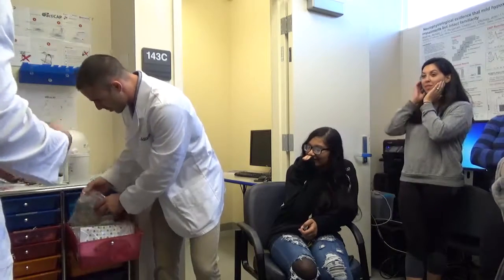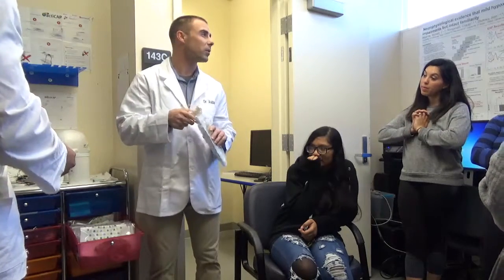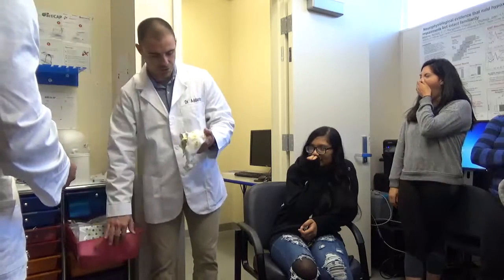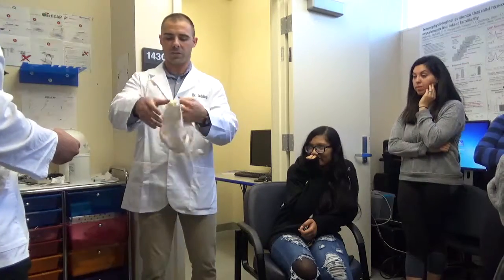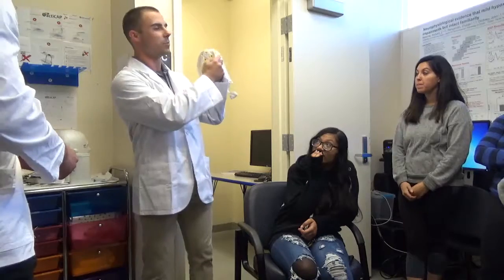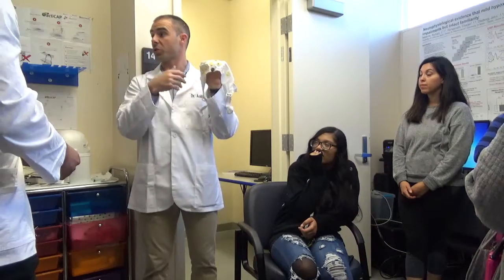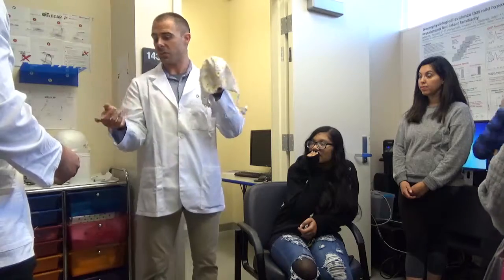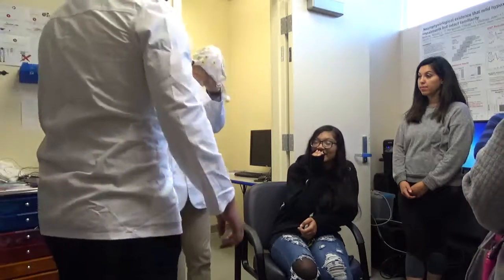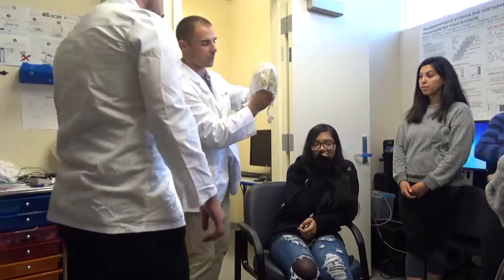Yeah. So, anyways, what do we say was 54? 57. 57, okay. So we have 56 and 58. Let's do 58 because we don't want it too tight on her. It's a long time to have something cramping down on your head. Alrighty, so let's see here. The way that this will work is, first of all, the black goes in front. And GND stands for ground. Like a lot of electrical measurements, we always want a ground measure. Okay? And so we'll work on it as a team to put that on. You can put that back down there. We start from the front, and the way we'll put it in front and then pull it in the back. So if you want to do that, you can grab the front and I'll pull it in the back.